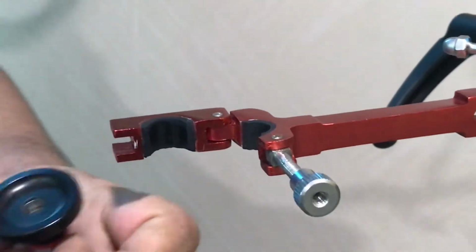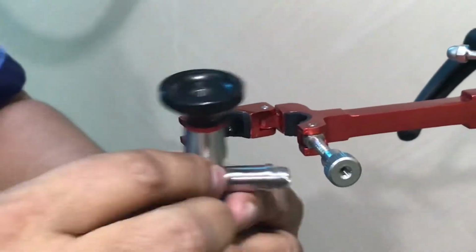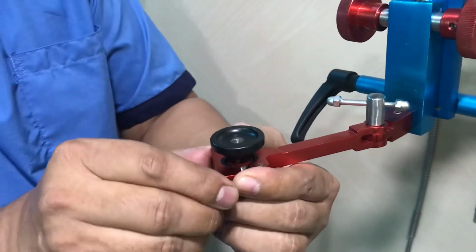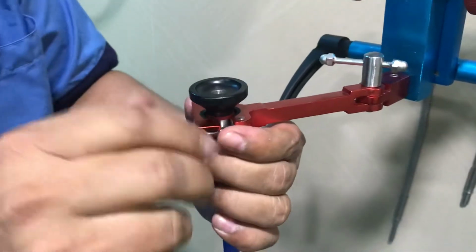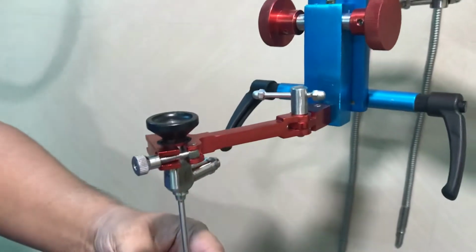You have to open and fix like this. Now, this is not the Karl Storz endoscope, so that's why it will not get fixed here. But the Karl Storz endoscopes get fixed. But if it is not getting fixed, just open it a little bit and it will grip. But you have to see that it firmly grips like this, and it is ready, okay?